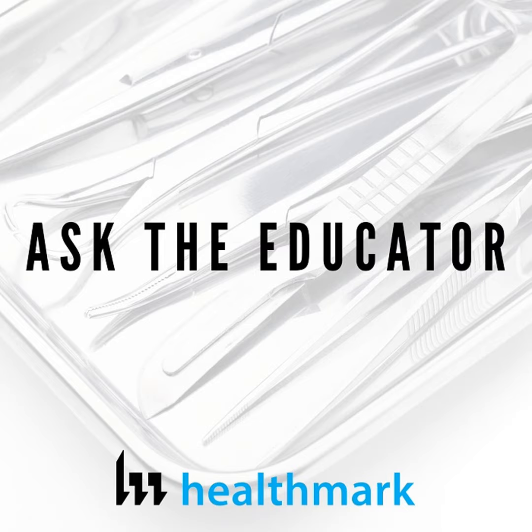So we looked at those systems, and we found that for SPD, the information gathered was really not specific enough to get back to the root cause of the problem. It was just a laundry list of this occurred, right? And who reported it, but it didn't give us specifics about what technician built that set, or what was specifically wrong with the set, or was it categorized so that you could sort and gather trends?